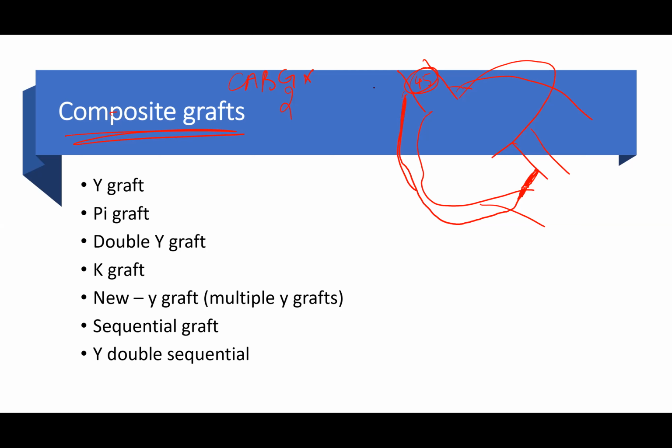At that time, we looked back and finally found the report, because we did not have the report at the time of doing this. Once we got the report, and sometimes your assistant can help with getting the report, it's very important to get the report. The other thing I said is that if there's a CT scan done, look at that CT scan to see where the graft is coming out of.